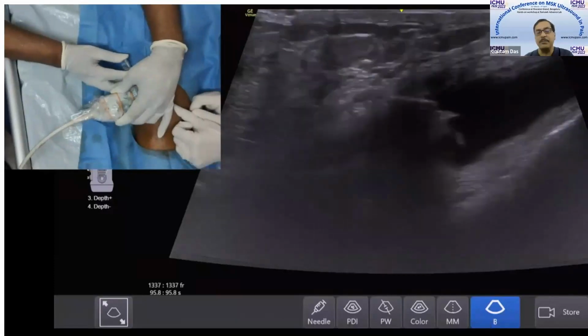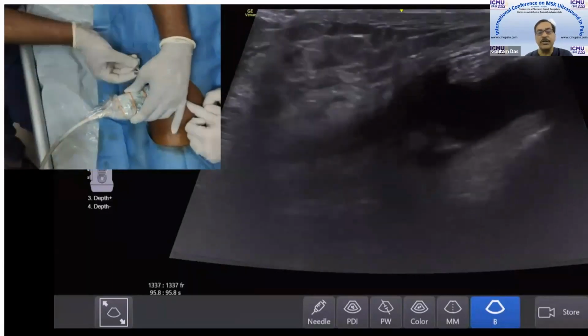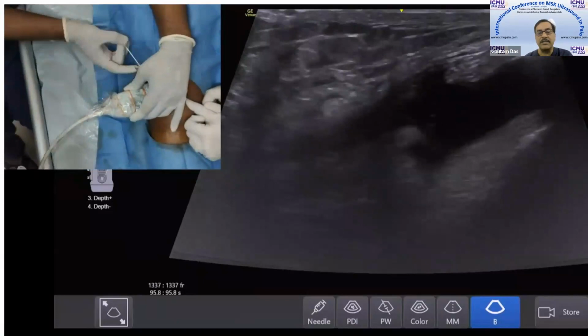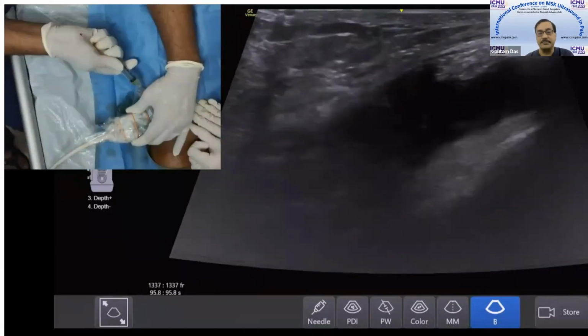And you might remember that most orthopedic surgeons, when they do this blindly, use these two approaches: just lateral side above the patella or below the patella, because here the synovial sac bulges.